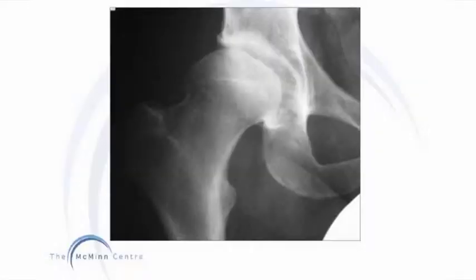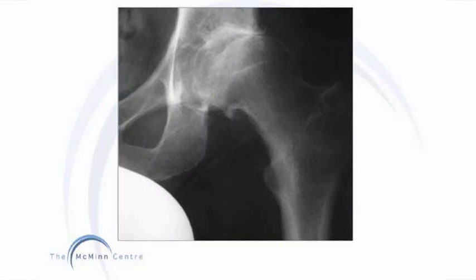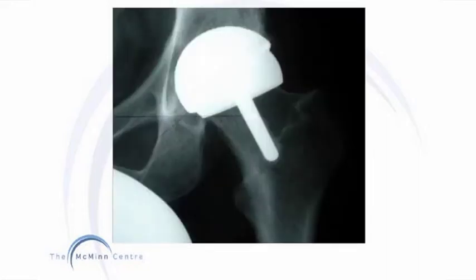Here is an X-ray of a normal right hip. There is a clear joint space where there is sufficient cartilage in this joint. This is an X-ray of an arthritic left hip. The cartilage is worn and the joint space is reduced. This is the same hip treated with a Birmingham hip resurfacing through a mini-incision approach.